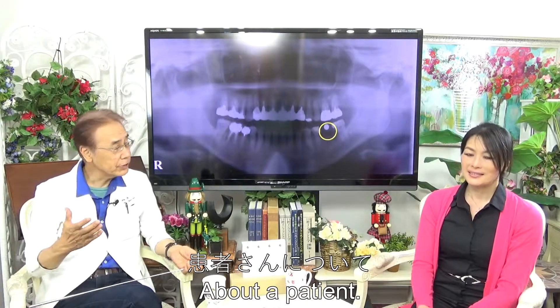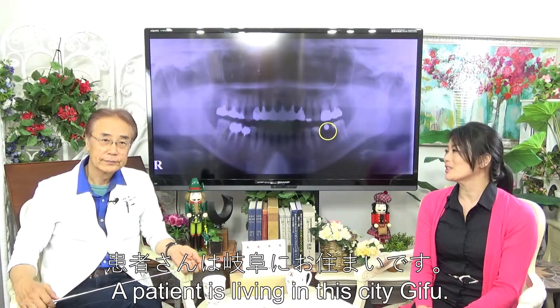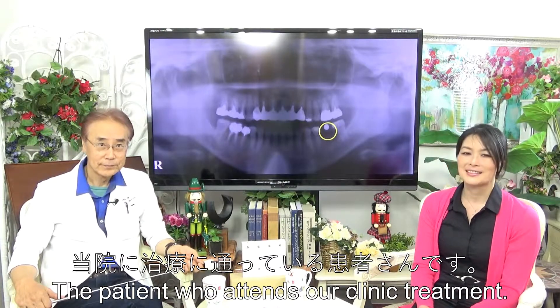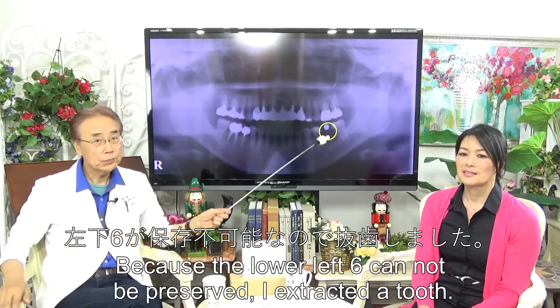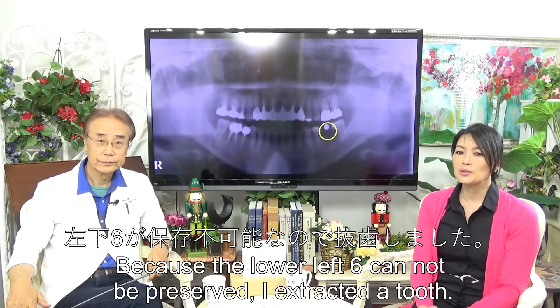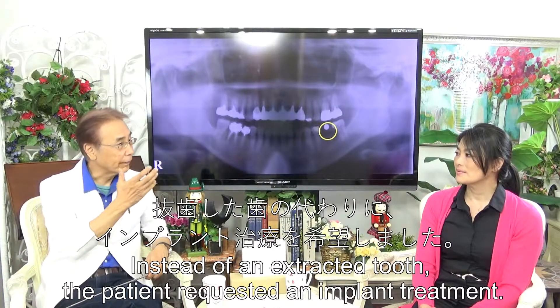About the patient: a patient living in this city attends our clinic for treatment. Because the lower left sixth tooth could not be preserved, I extracted the tooth. In place of the extracted tooth, the patient requested an implant treatment.